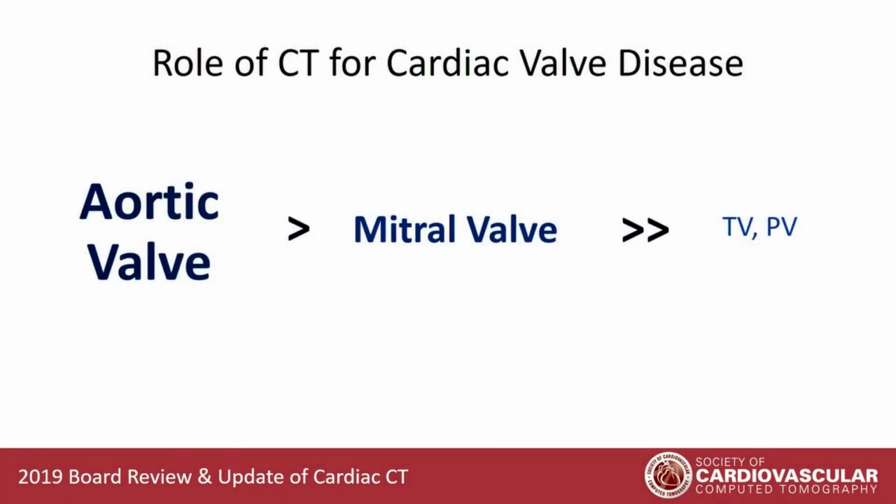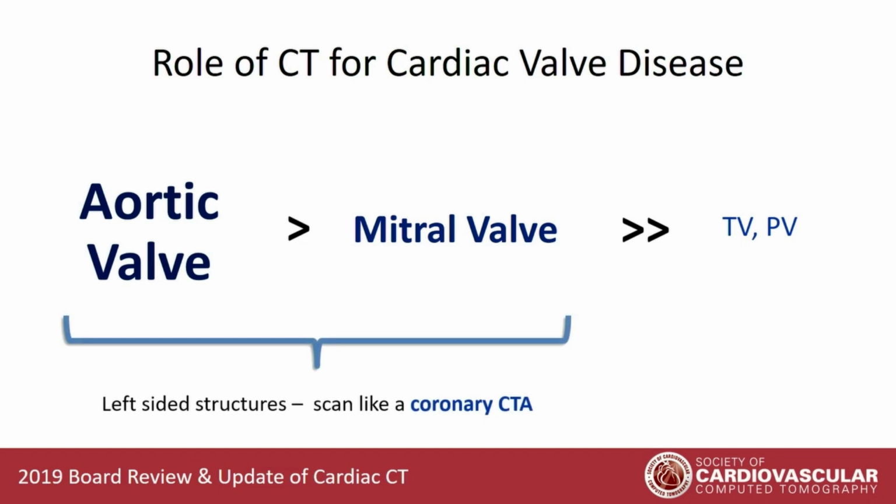Okay, and again, this is our hierarchy. As you know, the aortic valve and the mitral valve are left-sided cardiac structures. Your general coronary CT acquisition can be modified very slightly for really nice evaluation of the left-sided cardiac valves. Well, what about the right side of the heart?